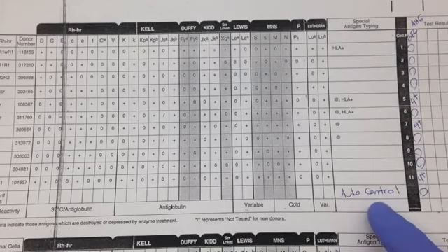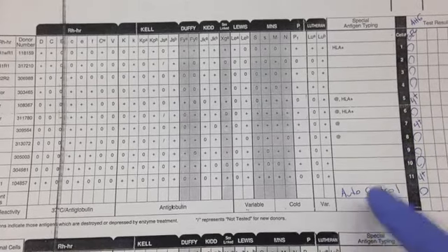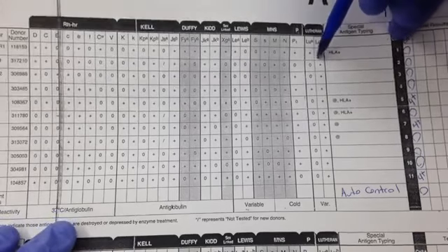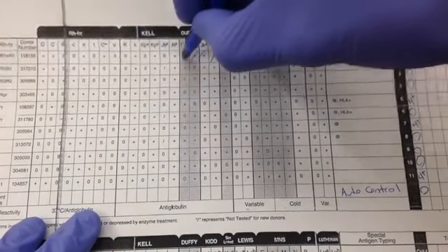I also want to point out that when you do a panel, typically you want to do an auto control. Now, some places might require you to do an auto control with your screens as well. And basically, an auto control is the patient's red blood cells mixed with their own plasma. And this is just a method of ruling out a warm autoantibody that might be causing positive reactions when it's just an autoantibody.